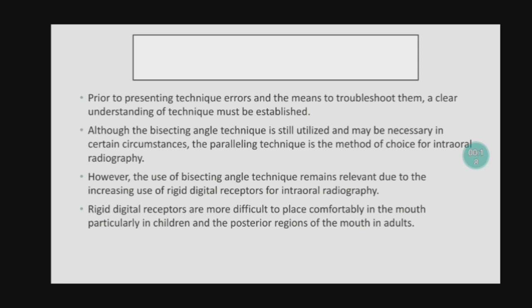Although the bisecting angle technique is still utilized and may be necessary in certain circumstances, the paralleling technique is the method of choice for intraoral radiography. However, the use of bisecting angle technique remains relevant due to the increasing use of rigid digital receptors for intraoral radiography. Rigid digital receptors are more difficult to place comfortably in the mouth, particularly in children, and the posterior regions of the mouth in adults.